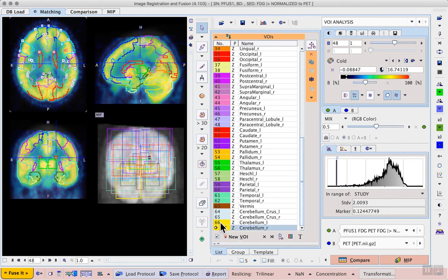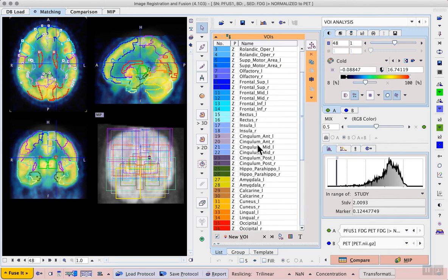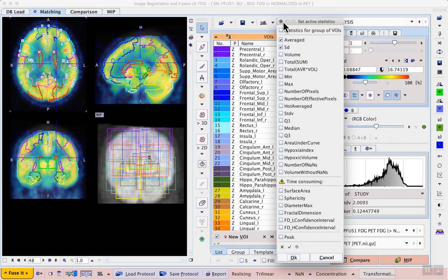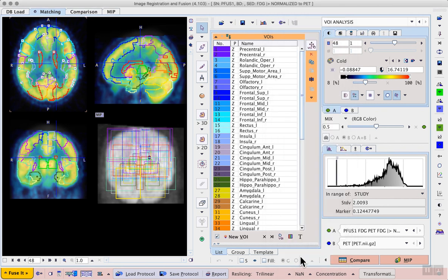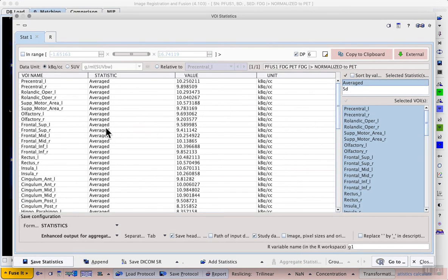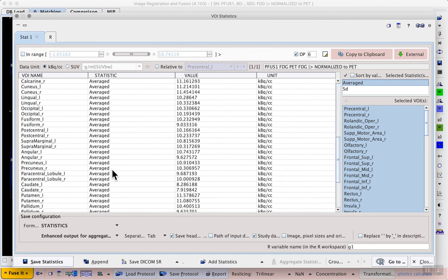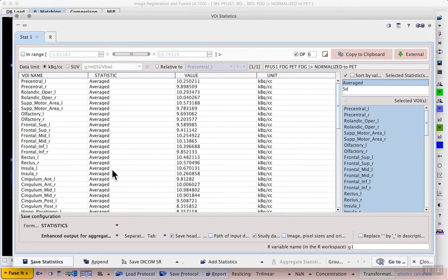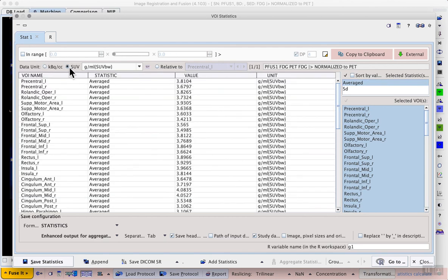Now that we have 67 VOIs applied to our PET data we can calculate the selected statistics. In this case saving time by only calculating the average and standard deviation. So we rapidly have statistics for the full brain based on these atlas VOIs and again where the SUV information is available we can directly switch to SUV in the top left of the statistics dialog.